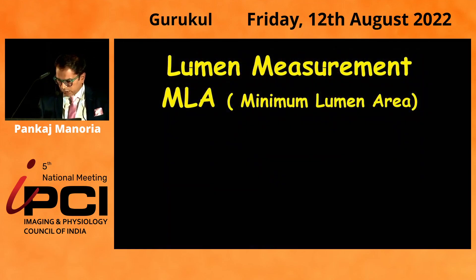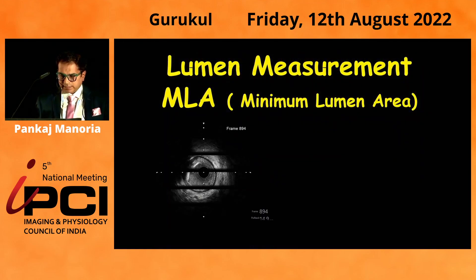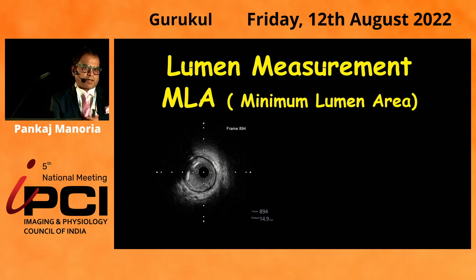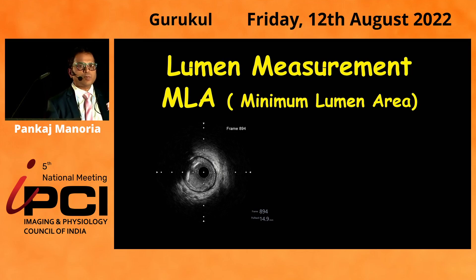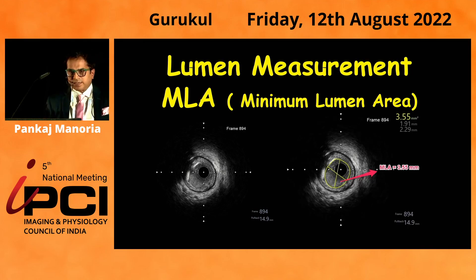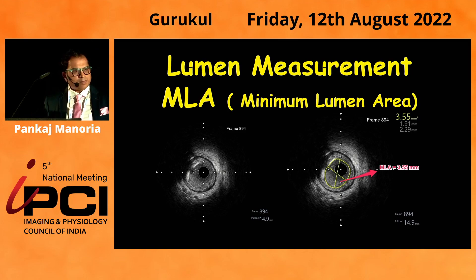The first and foremost important point is: what is an MLA? Before identifying what is an MLA, we need to identify where is the intima-lumen interface, then only we will be able to identify the MLA. Once you circle that interface, the area inside is the MLA.